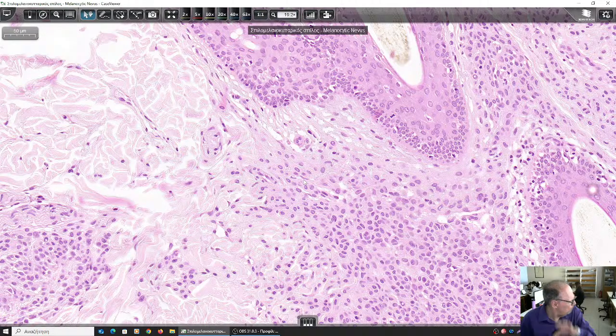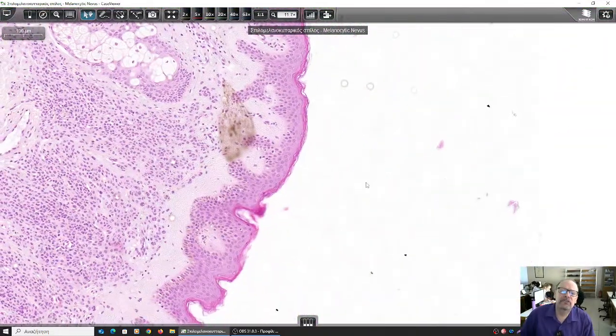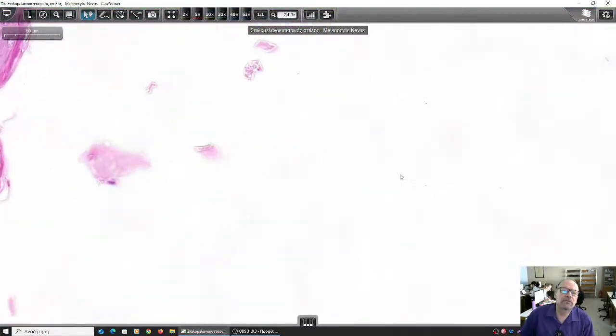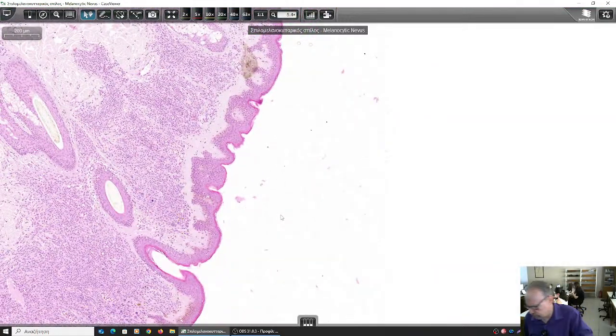So, the main features to differentiate an intradermal melanocytic nevus is this one, intradermal. Let me see, does it have a junctional component as well? That means, do we see nests of melanocytes within the epidermis? No, I don't think so. Here there are separate melanocytes. They are not nests.